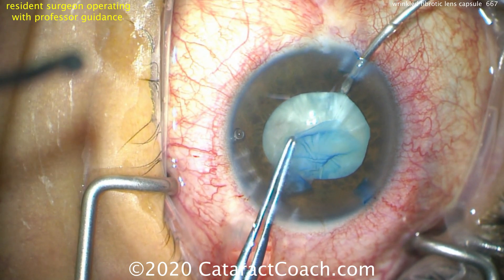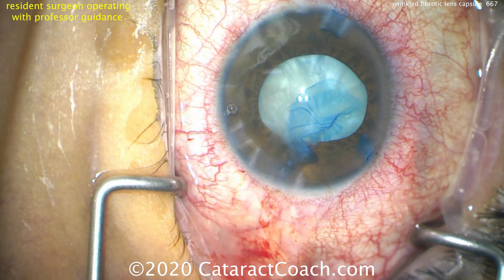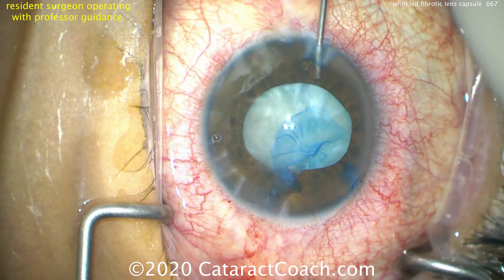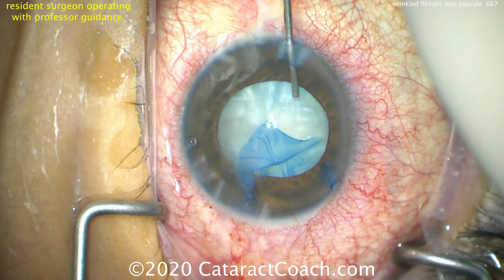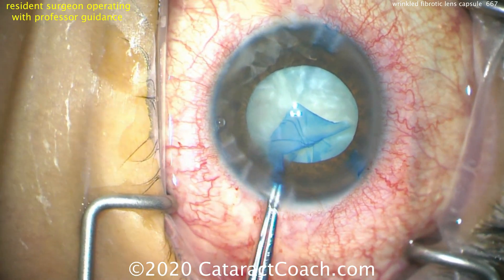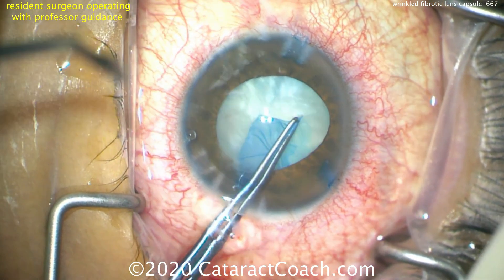Watch carefully making sure it doesn't run out — it has a tendency to, so we have to stop and put in more viscoelastic. Change the force vector in how we're pulling it. There's the edge — it has not run out to the zonules yet, so we're safe. We can grab that and bring it in, and again our goal is to encompass as much of this wrinkled anterior lens capsule as we can within the rhexis.